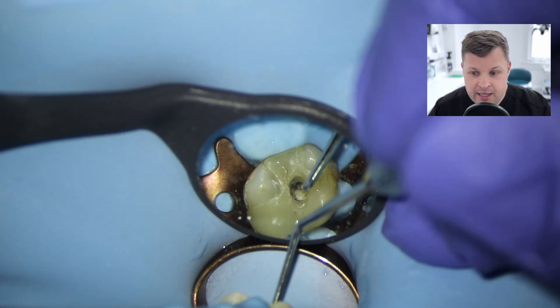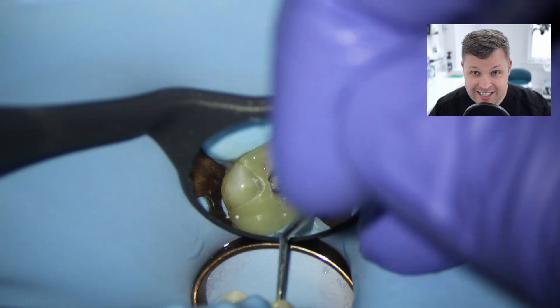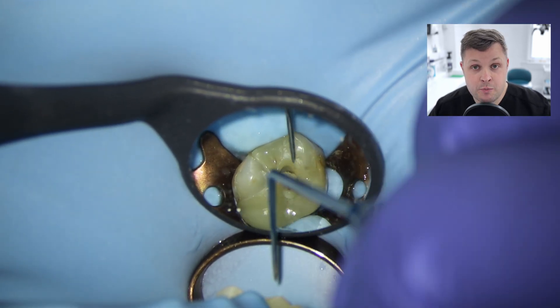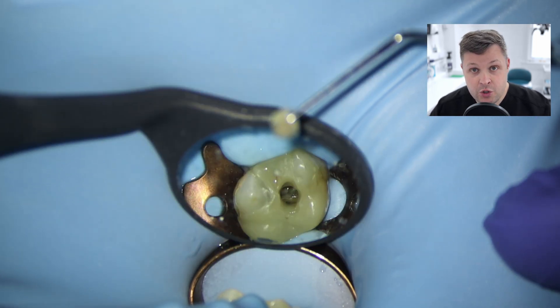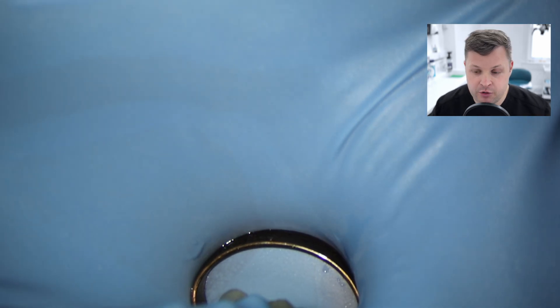Here I am just trying to remove the cotton wool pledget that's been placed in here as a temporary filling. I don't like to use cotton wool - I like to use PTFE - because as you can see, it's a bit fiddly to get the cotton wool out. And sometimes when you're using cotton wool and you put the GIC on top, it can get enmeshed and it can be difficult to remove.